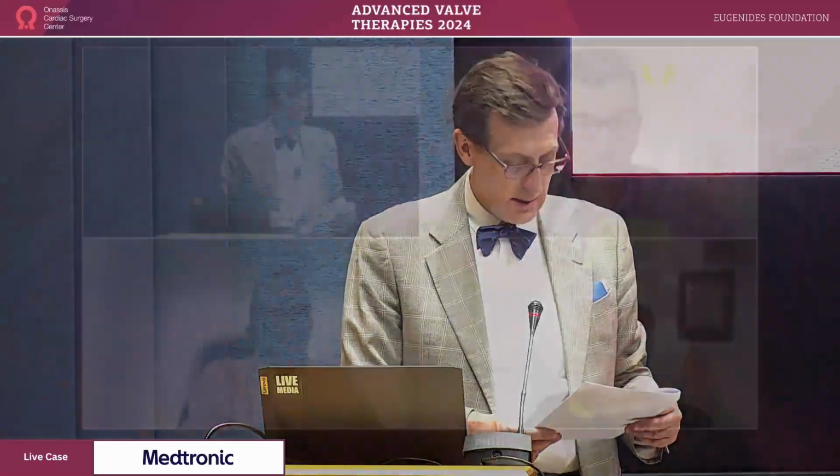Online, Dr. Latsios, Dr. Toutouzas, Dr. Dardas, and right here with us, Dr. Katsimagklis and Dr. Spilias, as well as Dr. Papadis here with the heart surgeon of the panel. Minimalistic TAVR. As soon as we're ready, we can fire the connection. Go ahead.